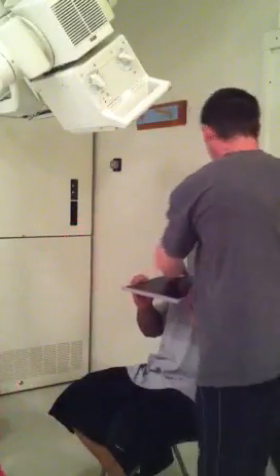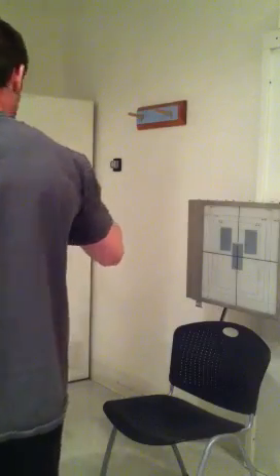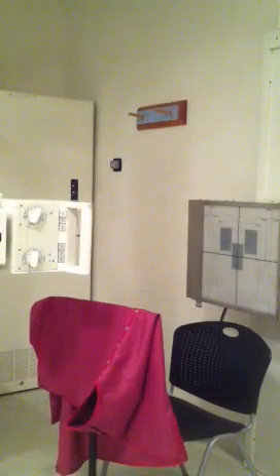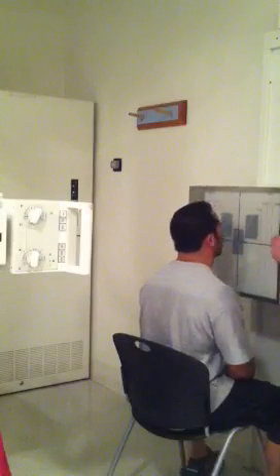You can relax, Mike. I'd go run this. Okay, go ahead and stand up for me — watch your head. I'm going to set up the room for the PA mandible. Okay, this is the PA mandibular rami, and the patient is seated.